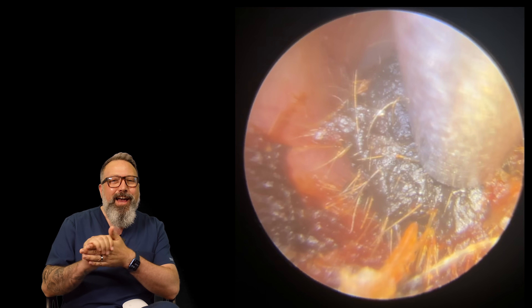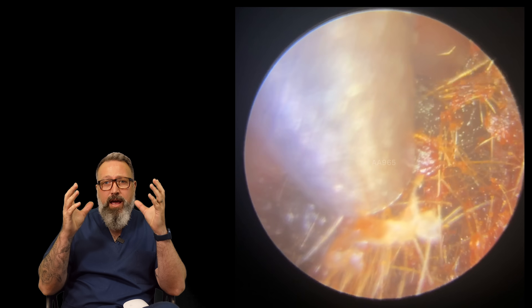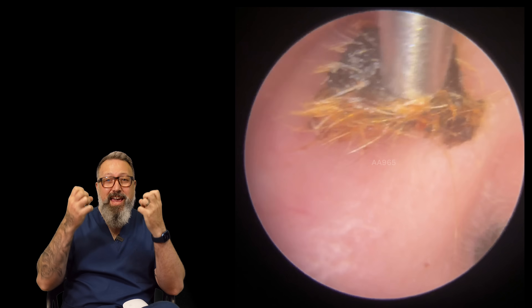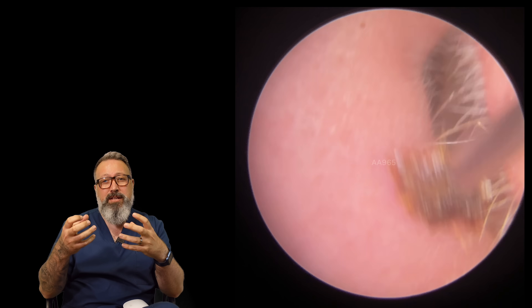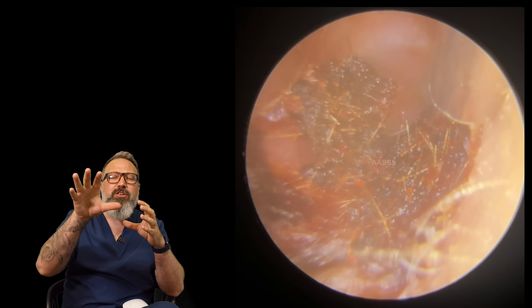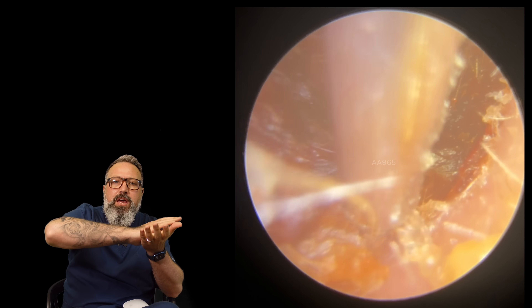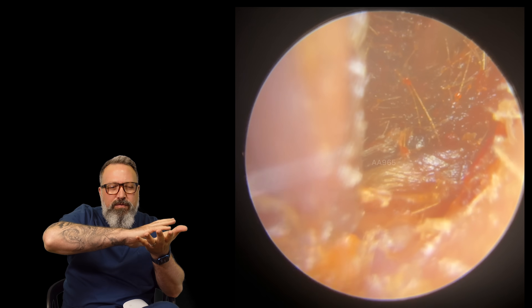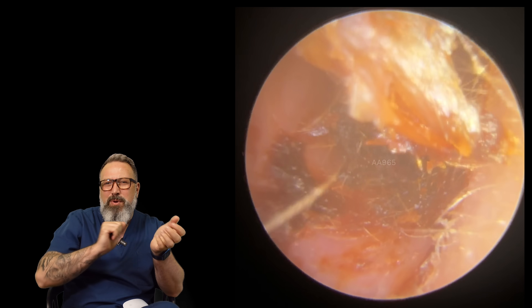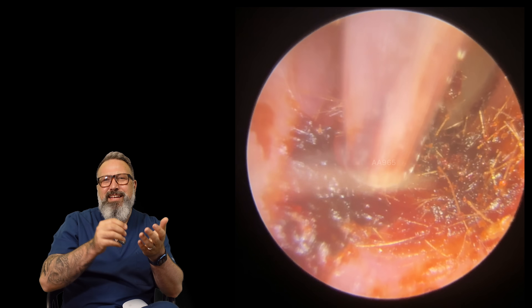In this first patient's ear canal, they weren't feeling particularly blocked up or experiencing any hearing loss, but we can see a really stiff, hairy, dark ear wax plug. There's also a very thin dry skin layer - imagine a thick layer of skin that's all dried up with a smattering of wax over the top, giving it a waxy appearance.